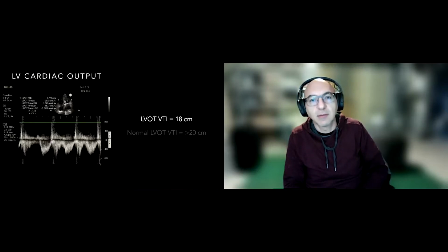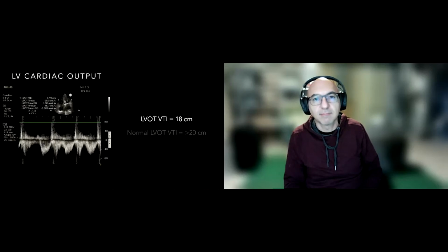Yeah, and maybe another example, just to further solidify it. This is kind of an unrealistic scenario because there are a lot of other competing medical interests in this situation. But for our trauma colleagues, we're very accustomed to seeing patients who are hypoperfused and hyperdynamic, right? Think about the GSW to the belly that's bleeding into the belly, or an open long bone injury that's bleeding onto the street, things like that.